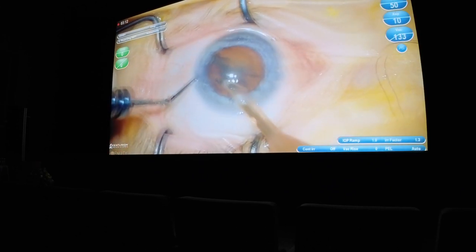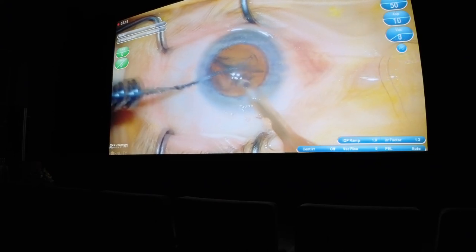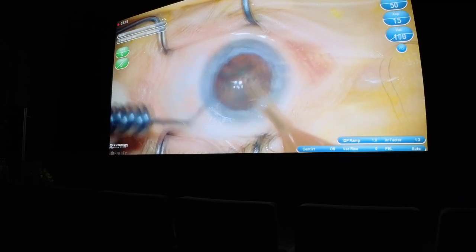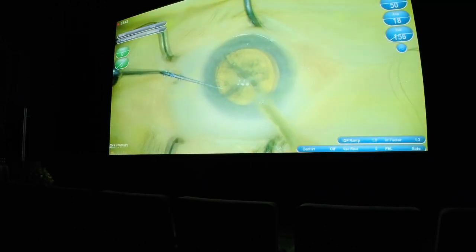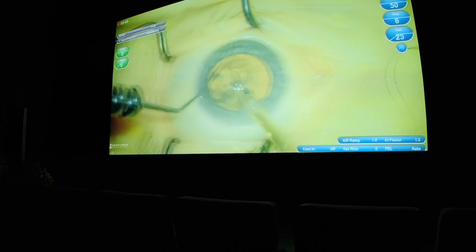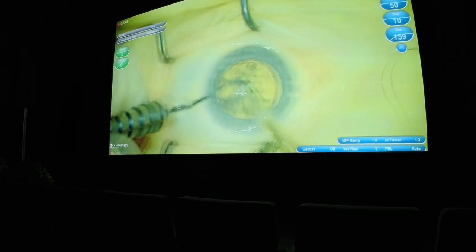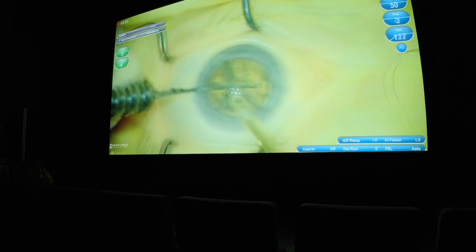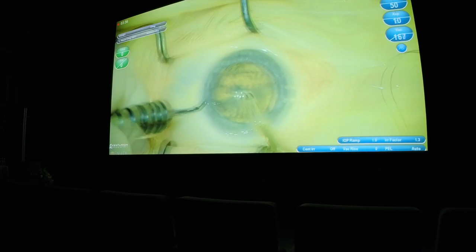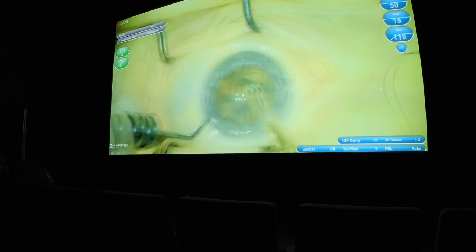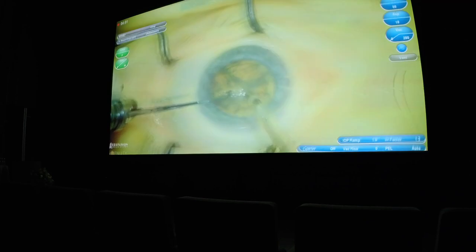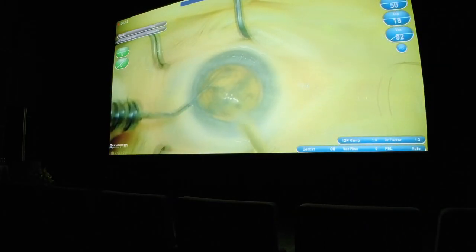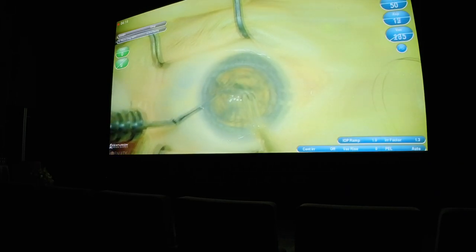Here is another case where we start with normal image representation. I'm using horizontal chop. Now a filter is applied — in my opinion there is a little more visual information we can have from the nucleus. The nucleus is more transparent and the surgeon can approach it more confidently. Again, the regular image.